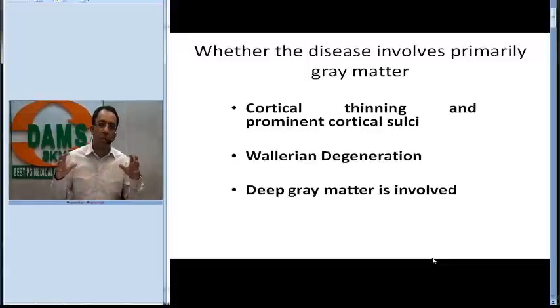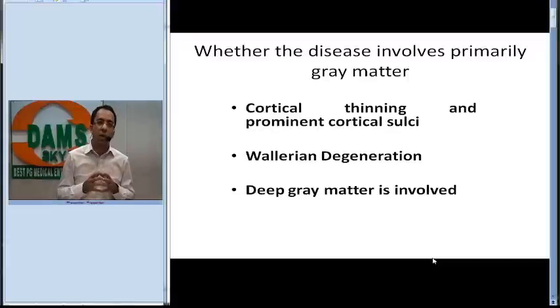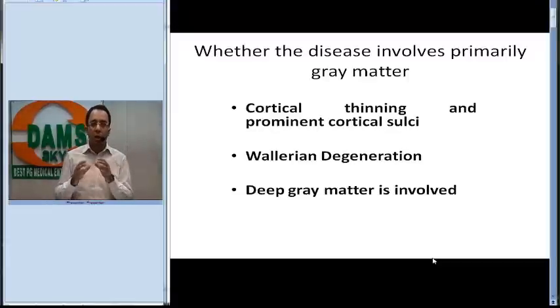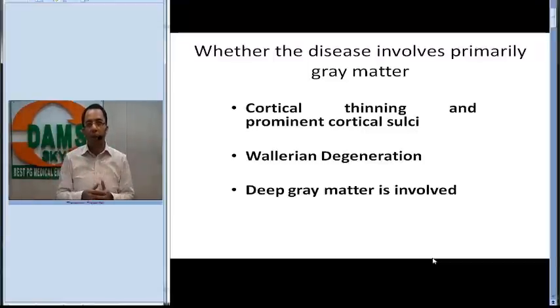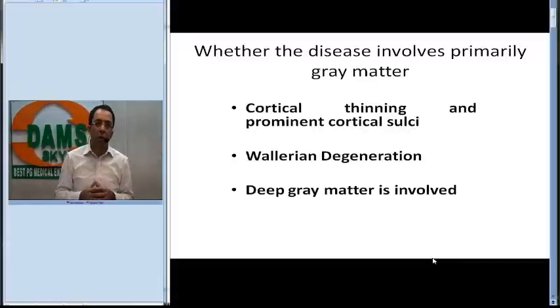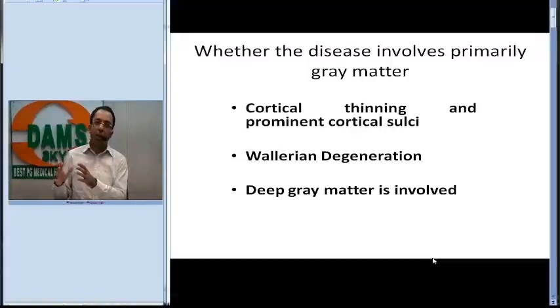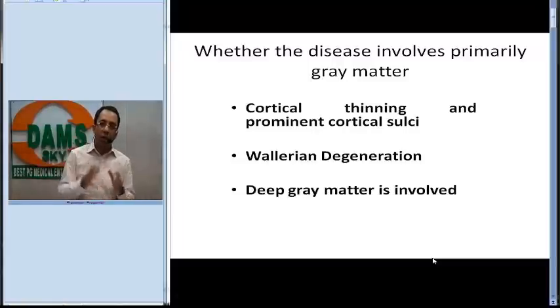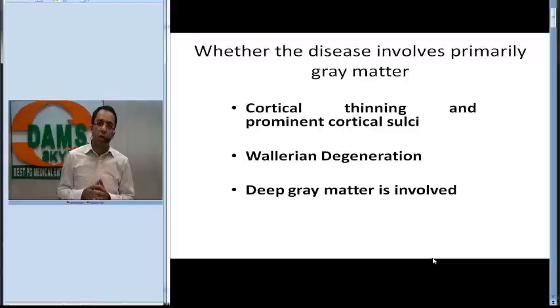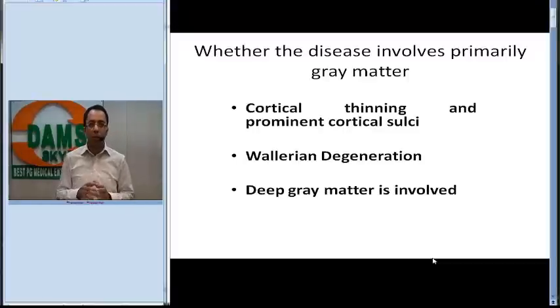Whenever you see abnormal signal in the white matter with no evidence of volume loss, that is why doing MRI in an early phase of the disease is very important to characterize it. If you see white matter signal abnormality with maintained volume, we think of a white matter disorder. When we see cortical thinning, prominent sulci with Wallerian degeneration, and some volume loss in the white matter, we think of a gray matter disorder.